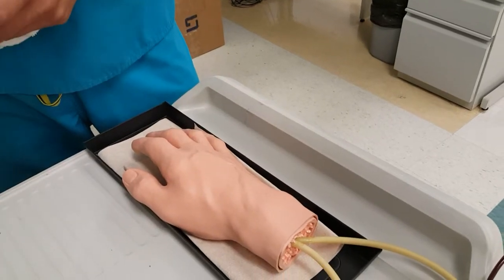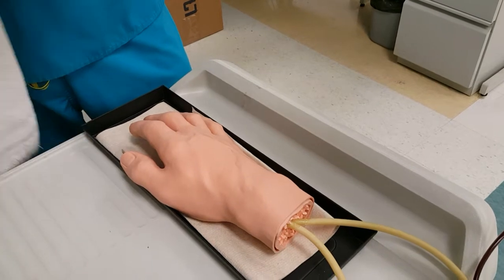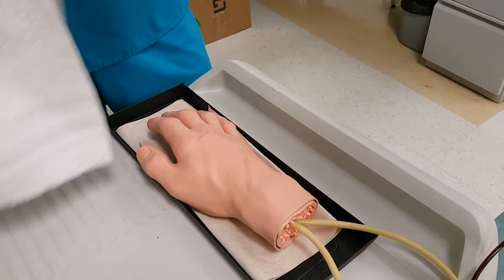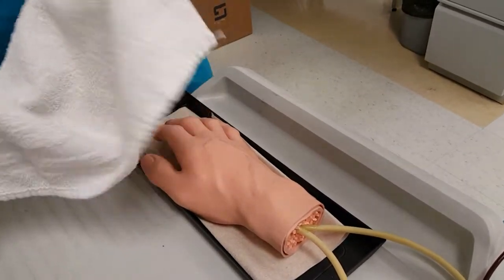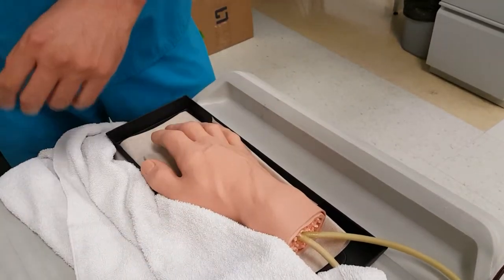This is how to start an IV. First you want to gather your materials. For those of you starting out with doing IVs, I highly recommend getting a towel because if you do make a mess, it's easier to clean up.